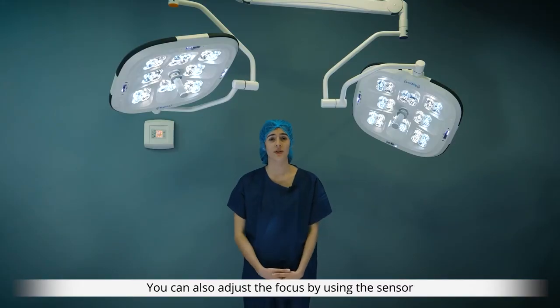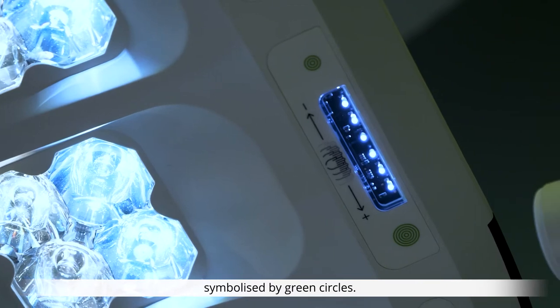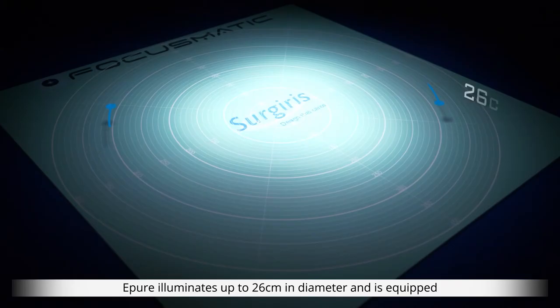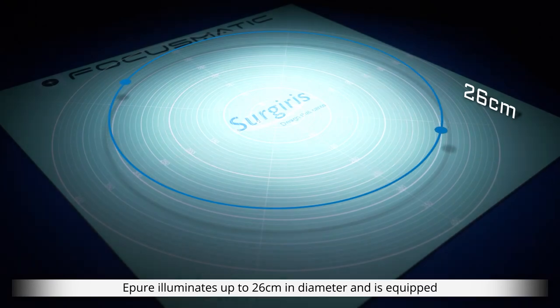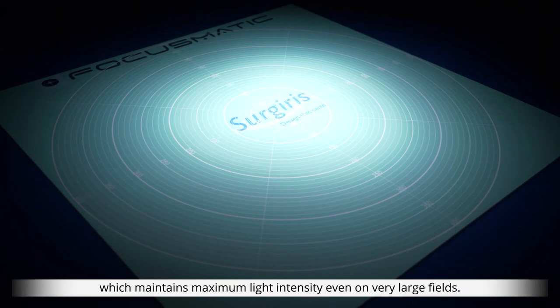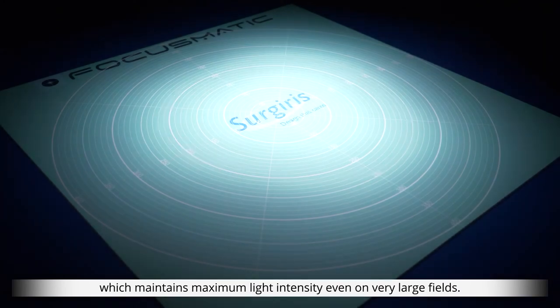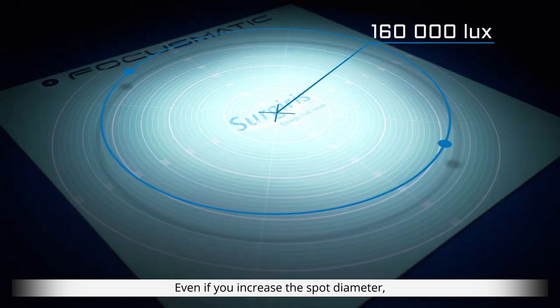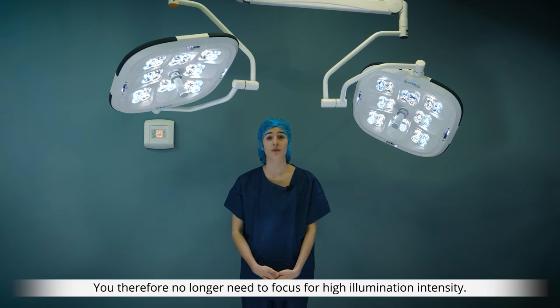You can also adjust the focus by using the sensor symbolized by green circles. ePure illuminates up to 26 centimeters in diameter and is equipped with the patented Focusmatic technology, which maintains maximum light intensity even on very large fields. Even if you increase the spot diameter, illumination intensity remains the same — you therefore no longer need to focus for high illumination intensity.